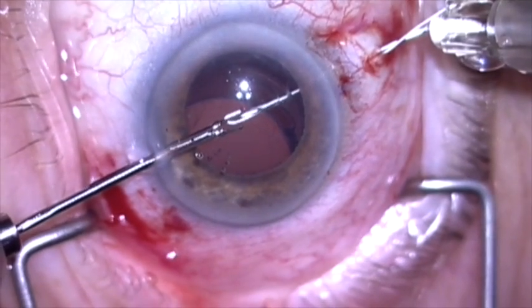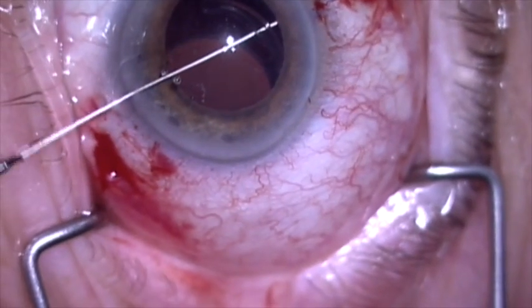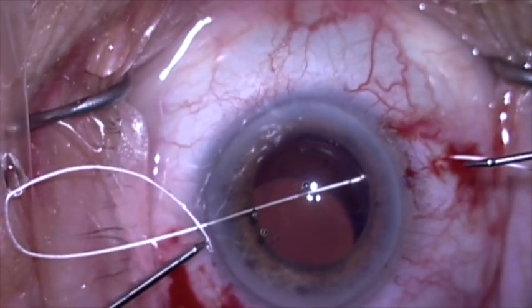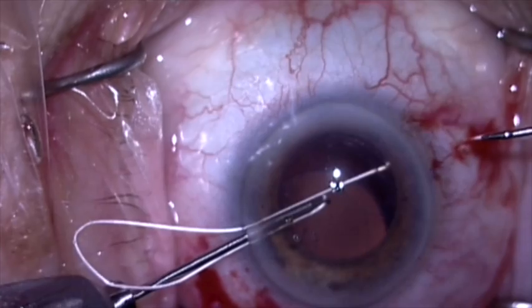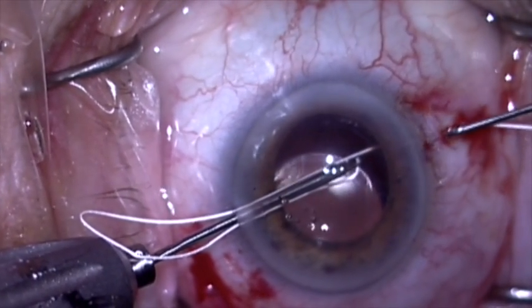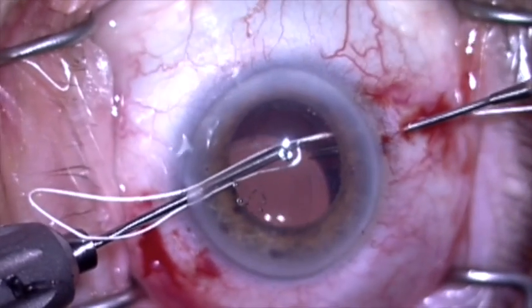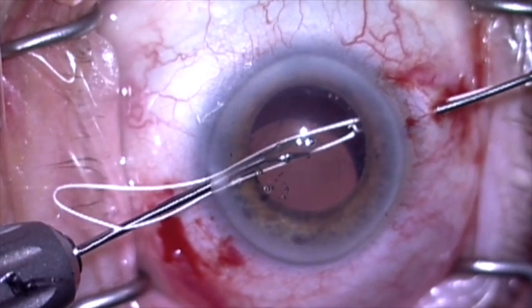Very controlled, as you can see. Now I'm going to grab that suture and pull it out the other side. I'm going to reintroduce the suture through the paracentesis and, using a 25 gauge forceps, I'm going to come through the sclerotomy at the top of my radial groove and retrieve the suture.